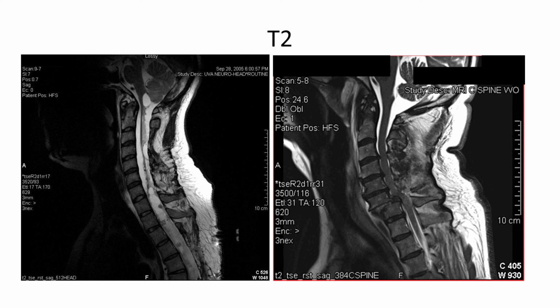You can see an anterolisthesis, meaning the cervical vertebrae have slid forward off of the spine here, and there's impingement on the spinal cord. The disc is pushing and causing a crush injury, basically, of the spinal cord. So this man was quadriplegic.